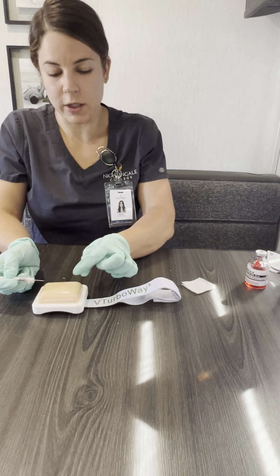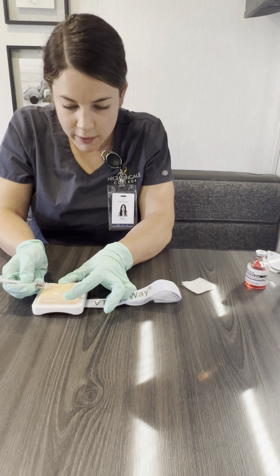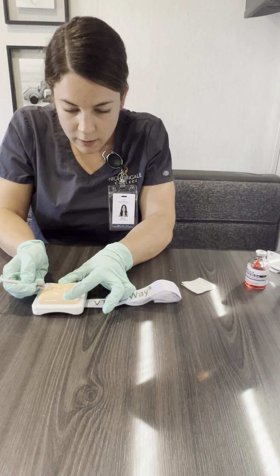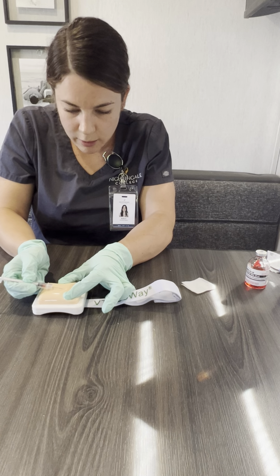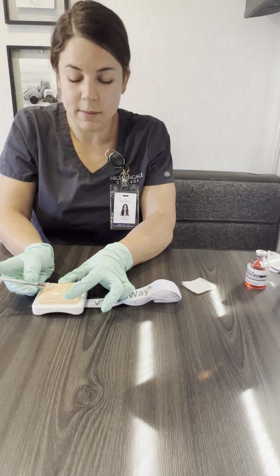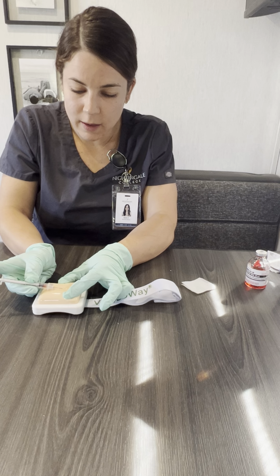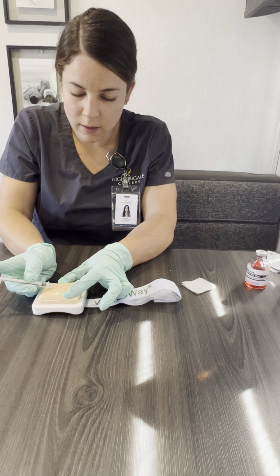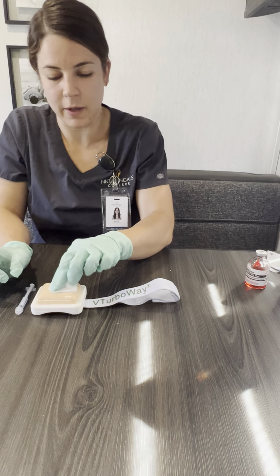First thing I want to make sure I do is pull the skin nice and tight. 5 to 15 degrees. There should be a little bit of resistance. If there's not, chances are you're not in the skin. Once it's in the skin, I'm going to slowly administer, then I'm going to put the gauze on it.